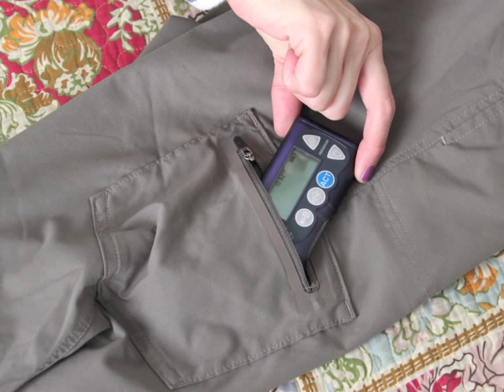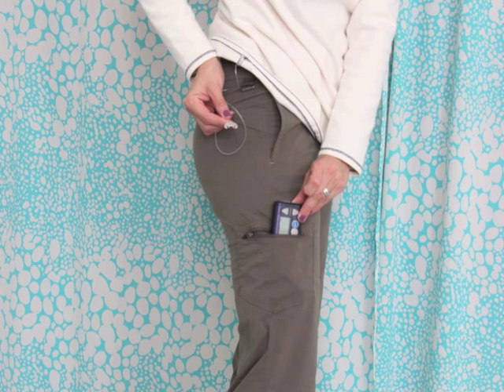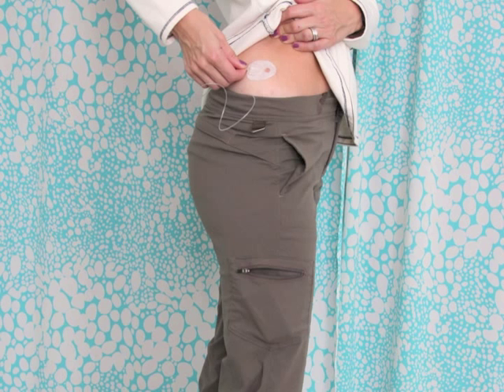Put the pump in the pocket. Now put your pants on and grab the catheter — it will be through the inside of your pants. Connect your catheter to your body.